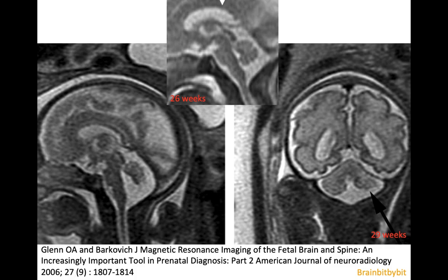Dandy-Walker malformation can be detected on intrauterine MRI. This is normal at 26 gestational weeks, and this is Dandy-Walker malformation. If you would measure the height of the vermis, you might be misled because of partial volume, so that's not useful. But you can look at the angle between the vermis and the tegmentum, which is increased because of the cyst in the posterior fossa. The problem with Dandy-Walker malformation is that there's no internalization of the rhombic lip, and on coronal images you can also see the hypoplasia of the cerebellum.